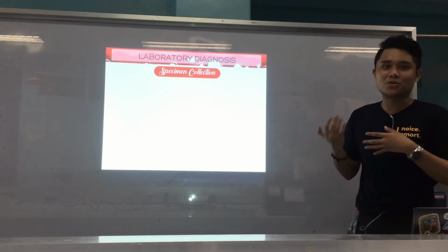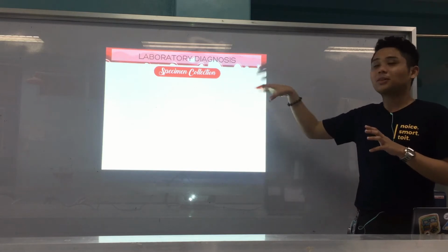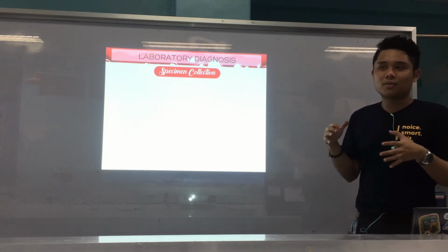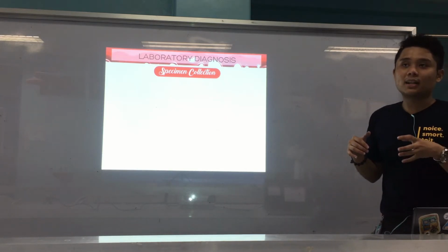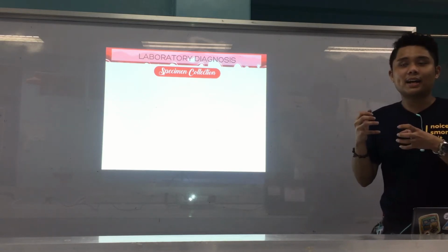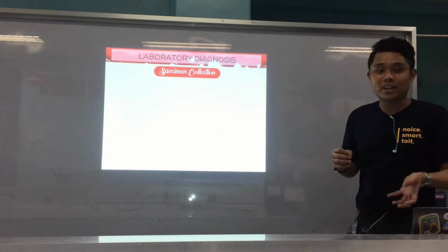That's why it's really significant we talk about blood culture, because the presence of any microbe there, except in cases of contamination, usually signifies a very important or significant condition of the patient.